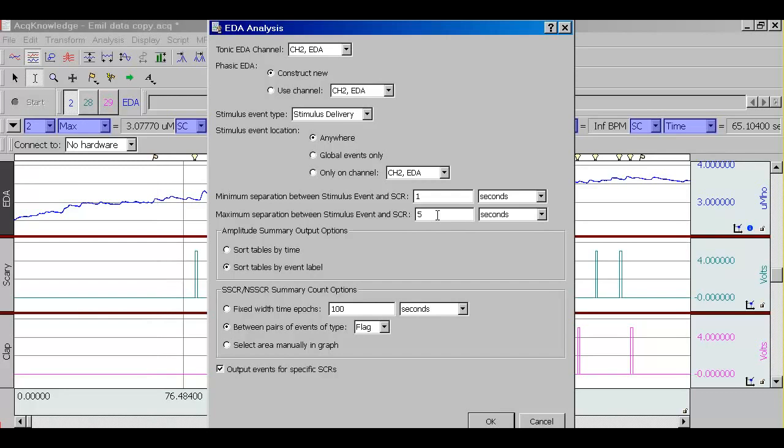So what the software will do is it will score the electrodermal activity data and provide you with two types of skin conductance events, specific and non-specific. The specific ones are those events that have been above the specific threshold that you set in the preferences, and also within a certain time interval following the stimulus presentation. And non-specific skin conductance events will be all the other events.